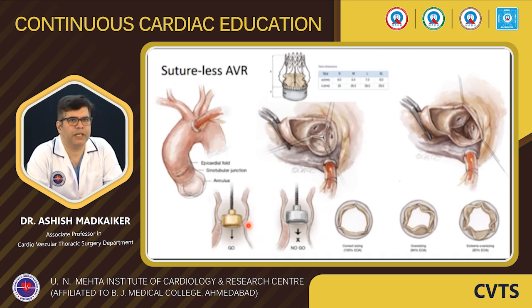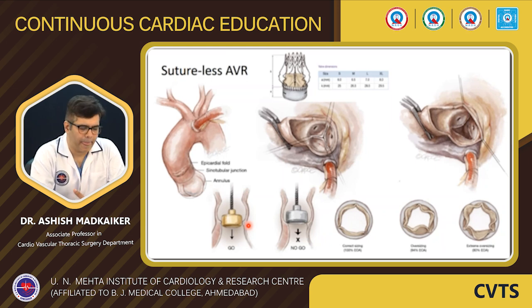Having seen how we conduct aortic valve replacement in the conventional manner, now we will focus our attention on certain developments that have happened, the kind of newer valves that we have, and what precautions we should take in these settings. So the first thing that we should consider when we are considering a sutureless valve is the aortotomy that we have to do. After standard cannulation and establishment of cardiopulmonary bypass, the aortotomy has to be very high, because the valve has two portions.